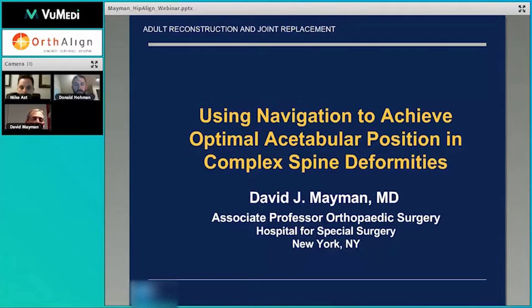And we've really recognized over the years that the patients that are at risk of dislocation are really the patients who have stiff spines where their pelvis doesn't move when they go from a standing to sitting position, or the people that we get fooled by. So if we go by anatomic position, but their pelvis is in a weird anatomic position, we're not necessarily in the functional position that we're trying to get to.